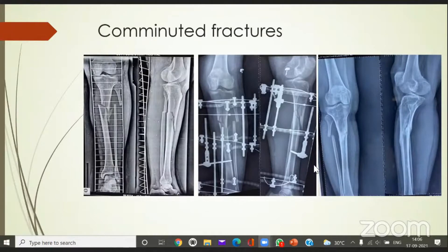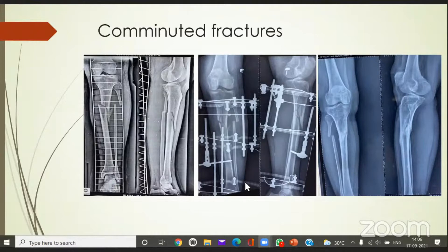However, if you want to be certain about the stability, you can always use drop pins, drop half pins, or you could use wires on posts as well. I wanted to demonstrate the use of olive wires. You see you have a translation on the fracture, so you can use counteracting olive wires — one from this side and another from the other side — so the fixation wouldn't wobble, wouldn't move, and it would give us solid fixation. This fracture went on to union nicely.